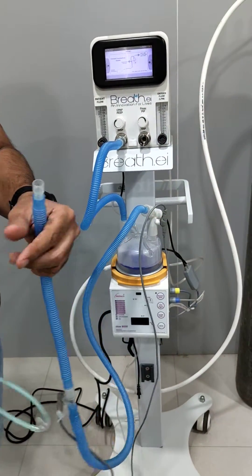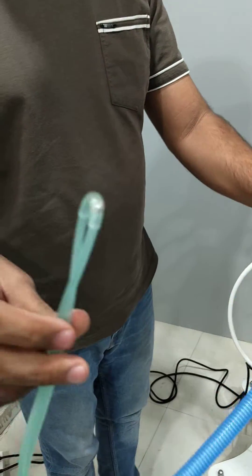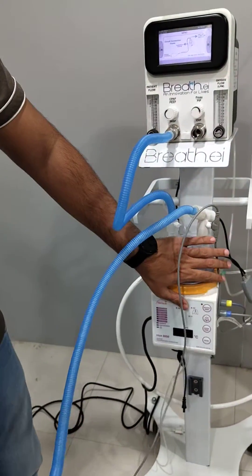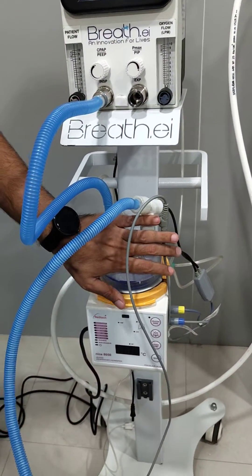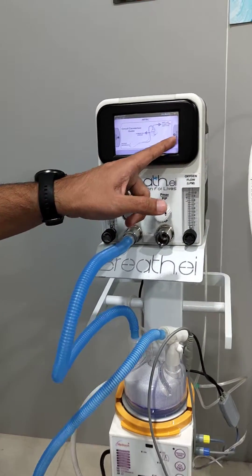We connect the appropriate nasal cannula to the circuit. This is simply our setup for HFNC. The humidifier cable and everything remains the same as for normal humidifier use. Now we start this mode.